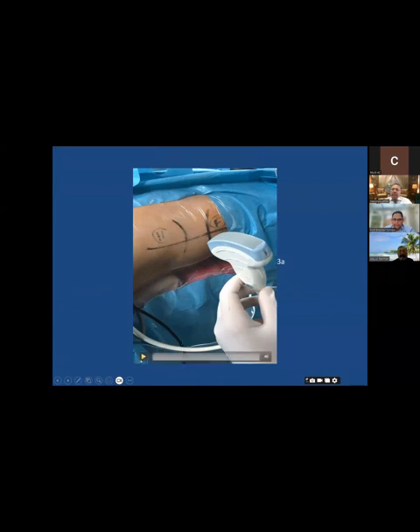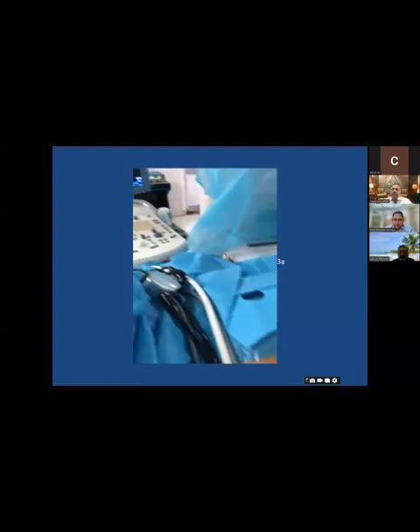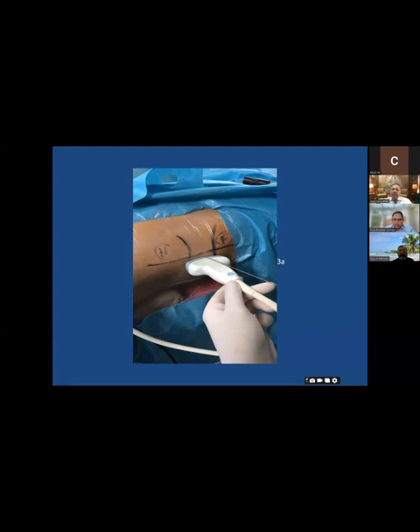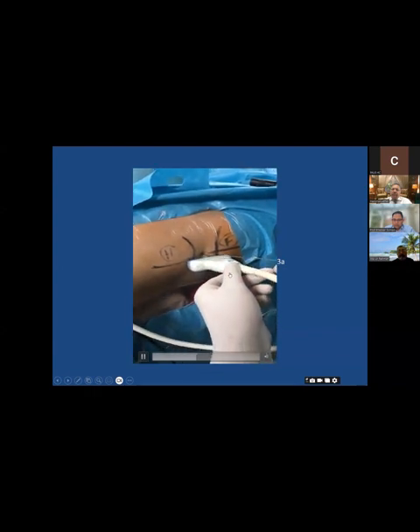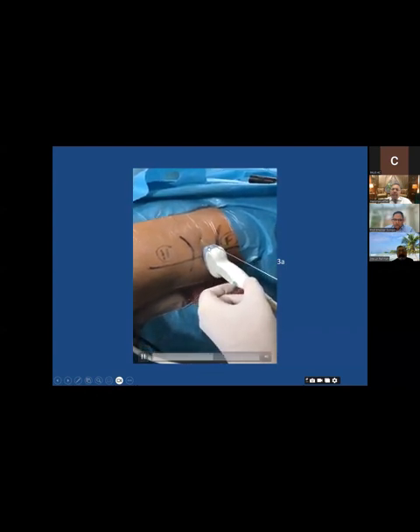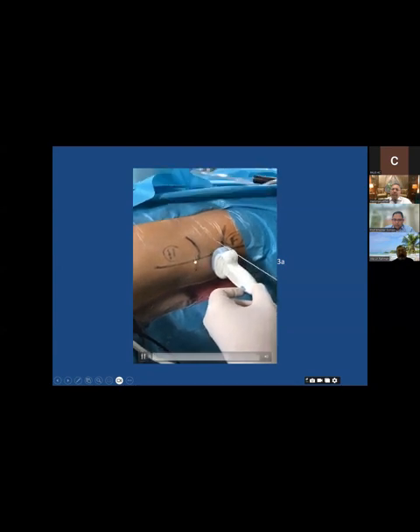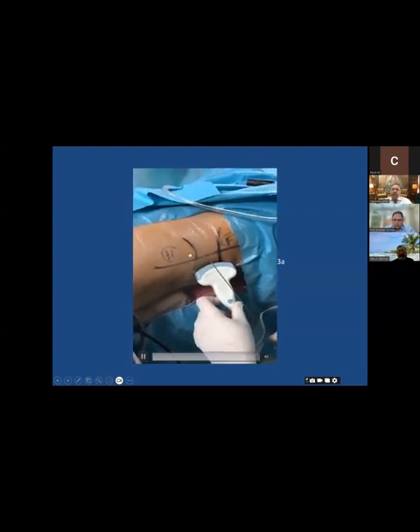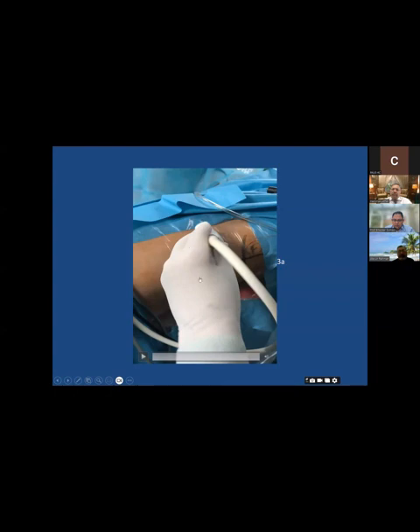In the next one, this is just a small video, which would show how to use the ultrasound. If you see, the needle moves with the probe. At one time when I was demonstrating this in Portsmouth, in UK, they told me this technique was given the name Gouge technique. Gough was the opener batsman for the British county. He used to look at the ball, at the bowler, and at the wicket. So you just look at the same view.